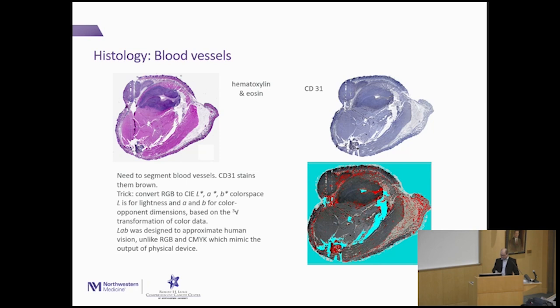So, moving back to something cancer related, I forgot to mention earlier that one of the things that we need to do, especially if we want quantitative imaging, is to ask: what is your ground truth? So in this case, we're looking at CD31 stain, a histological stain to mark the blood vessels. On the left here is just a standard H&E stain. You can see the tumor quite clearly. This is muscle, and then this is the same tumor there.